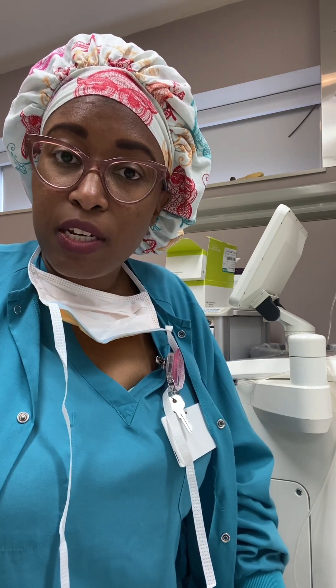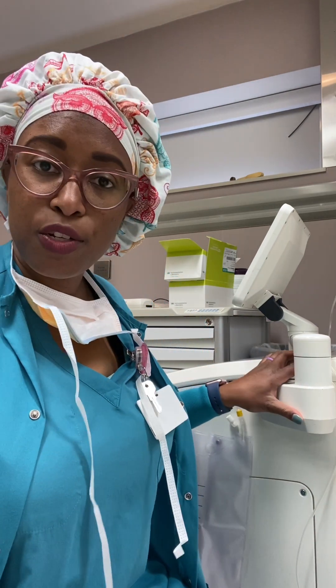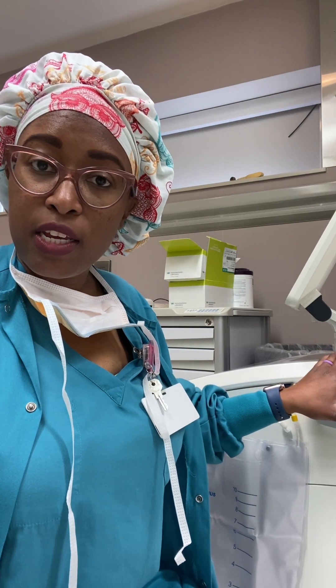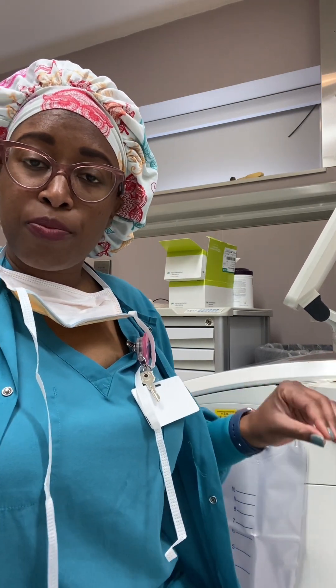One of the machines is called an auto transfusion machine. I will get into what it is, what it does, and what it looks like in a second, but just a brief overview.